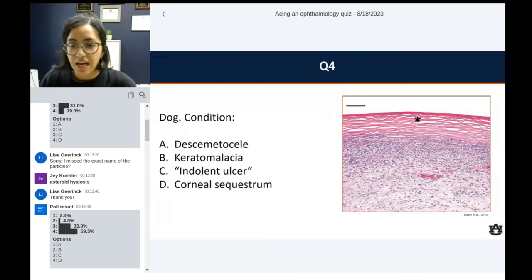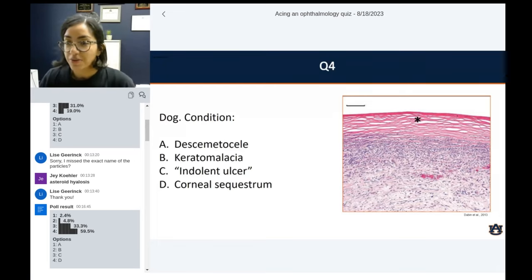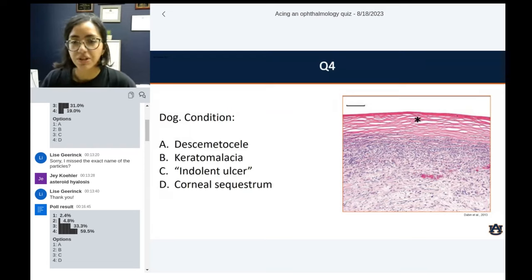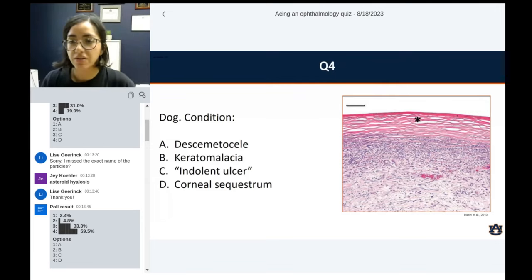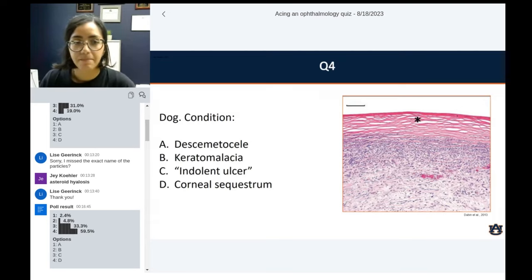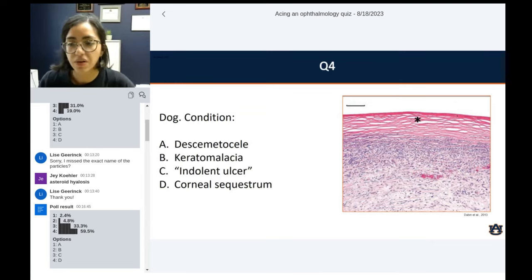Question number four. Based on all of my options, you can already know where the tissue is or what type of tissue. Is this condition a descemetocele, keratomalacia, indolent ulcer, or corneal sequestrum? I'm mostly interested in what is shown by the star — focus on the asterisk.